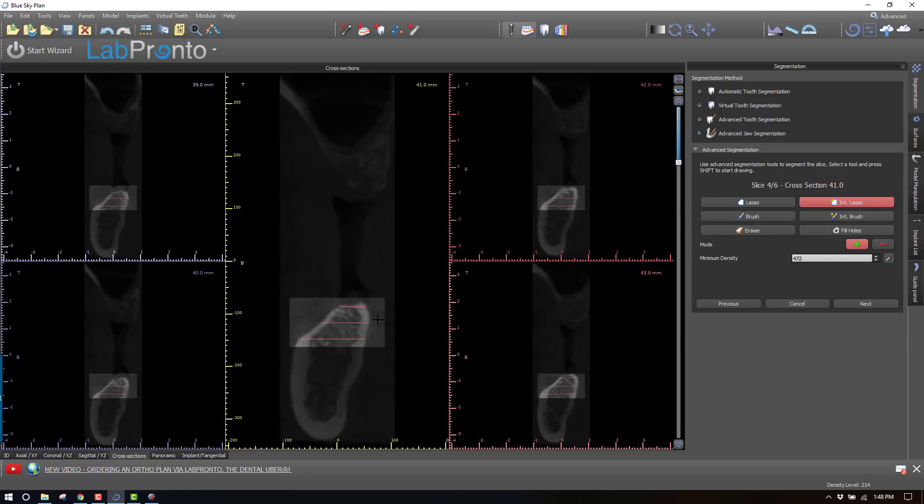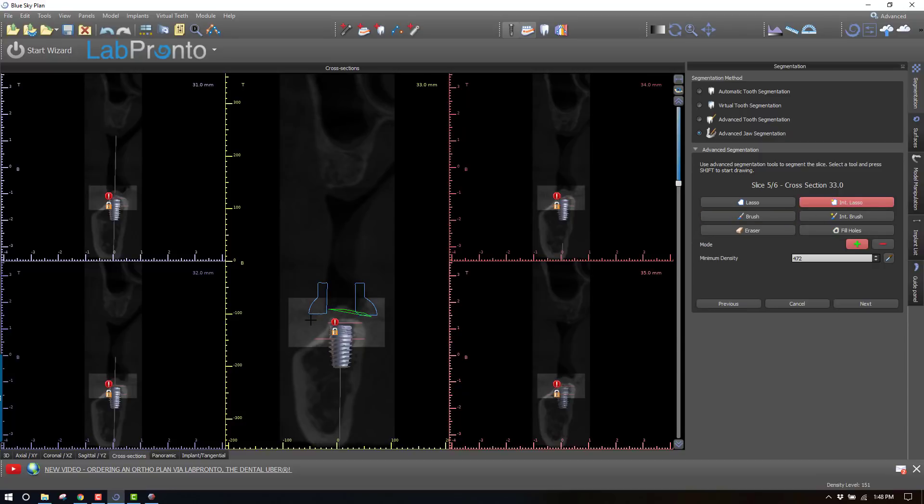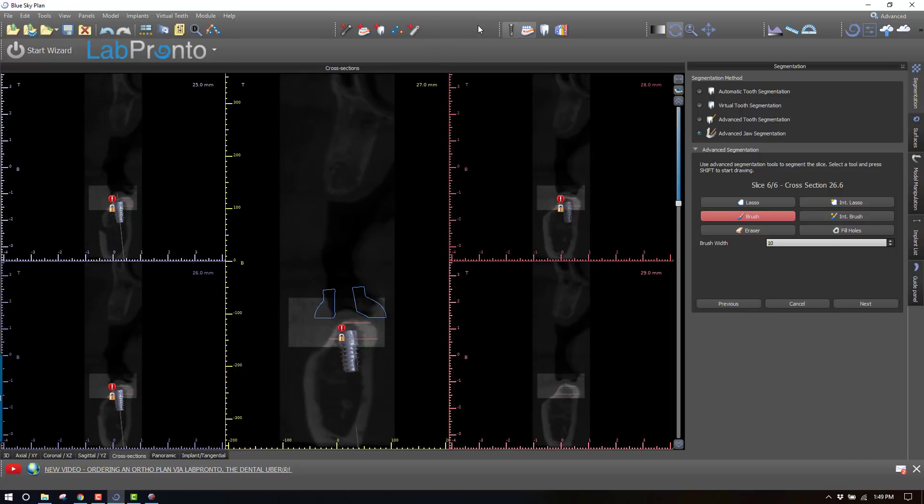Now it goes through a couple of cross-sectional slices and we do the exact same thing: intelligent lasso, use the brush, close it in from all sides, then fill the holes. Two more slices to do. You could certainly add more if you wanted to, but I don't think we're going to need much more in this case to get a good segmentation on just this very small piece of mandible. Close it with the brush and fill the holes. Next.